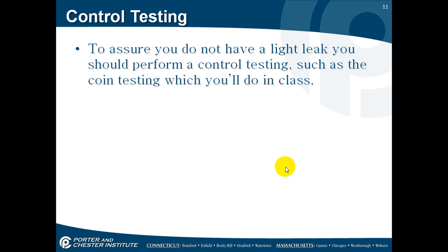To ensure that you have no light leak, you should do what's called control testing, such as a coin test. We're going to do that together in class.